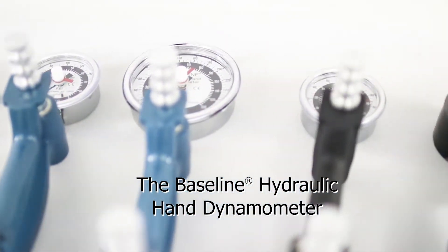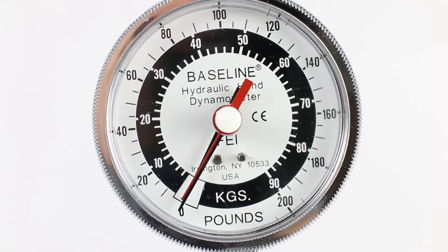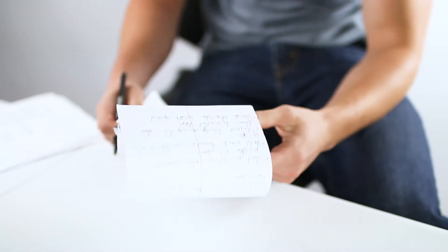The baseline hydraulic hand dynamometer gives accurate grip strength readings. This device is used to measure a baseline evaluation so that the therapist can set a plan of treatment.